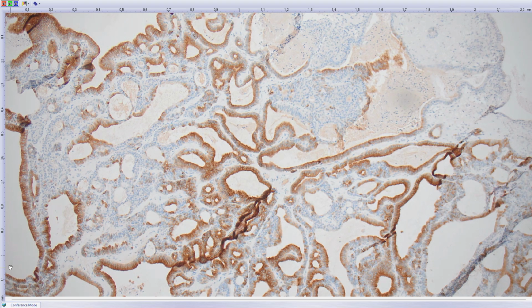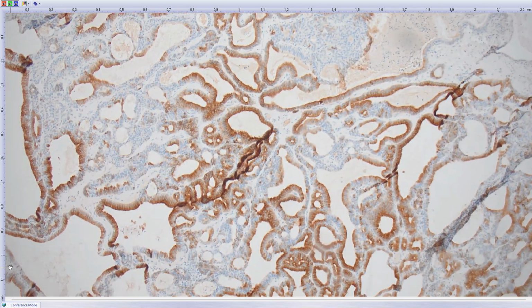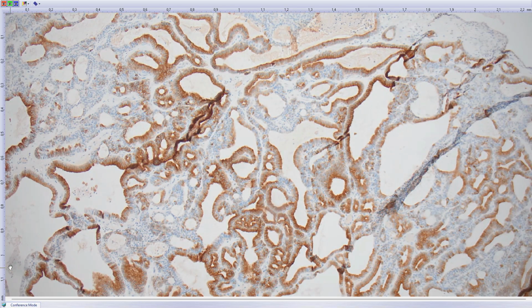And regarding the dysplasia, it's hard to grade these lesions, but if you see high-grade dysplasia, it's a second diagnosis. Okay, so you are not supposed to grade lesions like these. It's completely fine if you refer to it as pyloric gland adenoma without high-grade dysplasia.